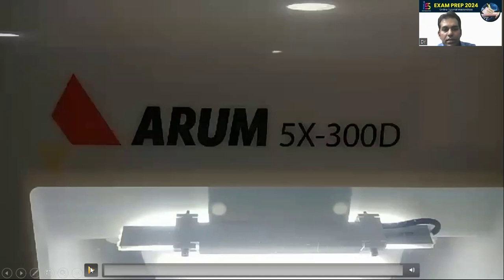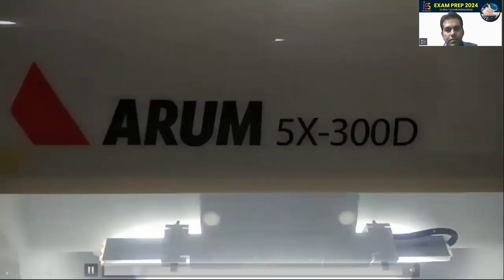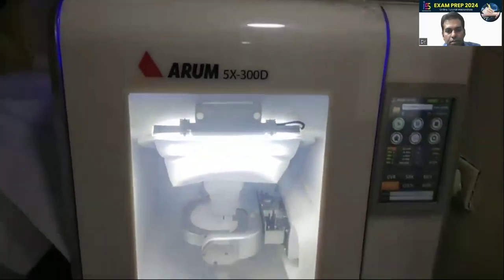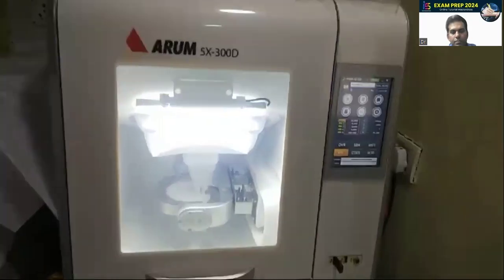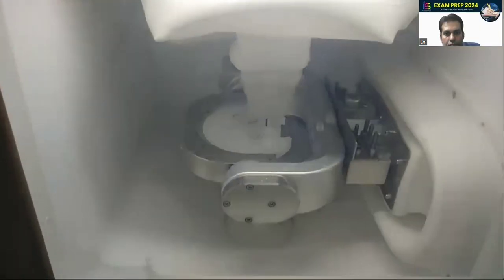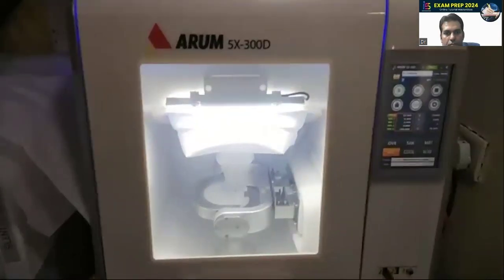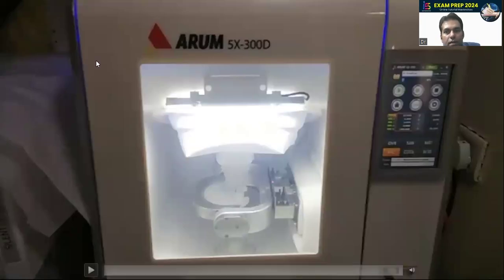Now, in this video, we are going to see the milling process. How does it take place? So here you can see these end mills.